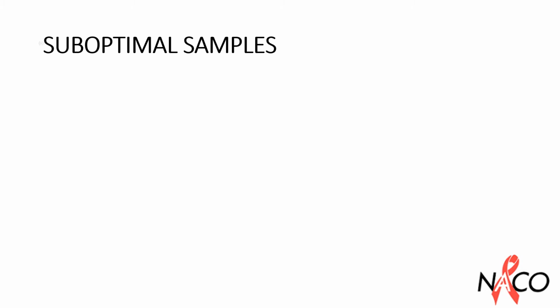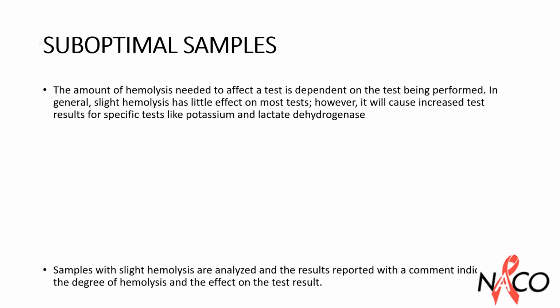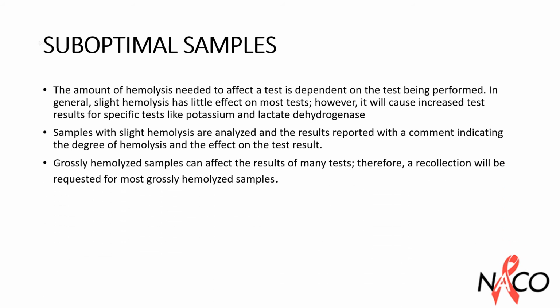It is important to note the amount of hemolysis needed to affect a test is dependent on the test being performed. In general, slight hemolysis has little effect on most tests. However, it will cause increased test results for specific tests like potassium and lactate dehydrogenase. Samples with slight hemolysis are analyzed and the results reported with a comment indicating the degree of hemolysis and the effect on the test result. Grossly hemolyzed samples can affect the results of many tests. Therefore, a recollection will be requested for most grossly hemolyzed samples.